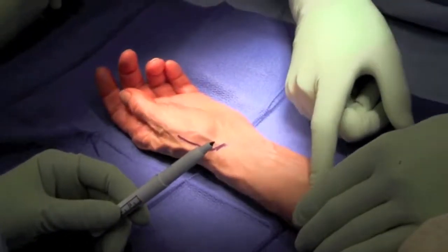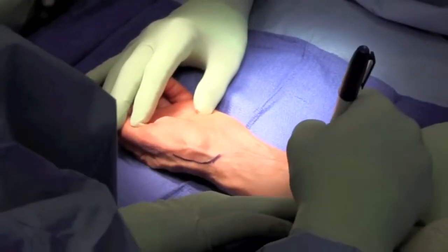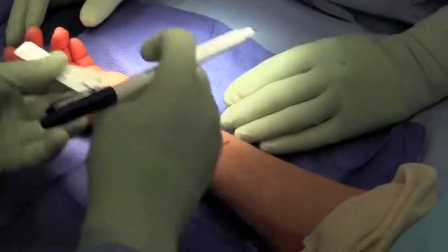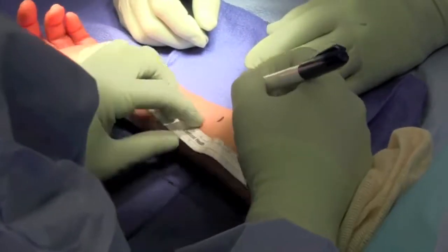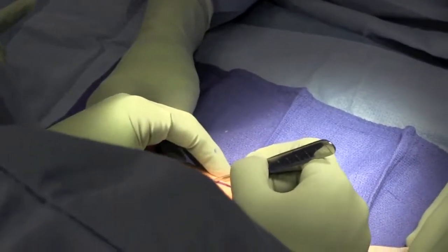Our entry point and our harvester are marked. Usually we'll harvest the flexor carpi radialis tendon approximately 10 centimeters above the proximal wrist crease. Stair-step incisions are typically made to remove that tendon.